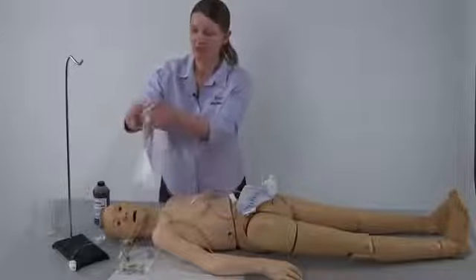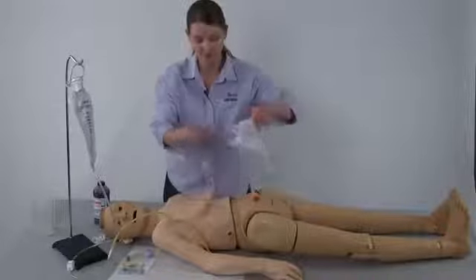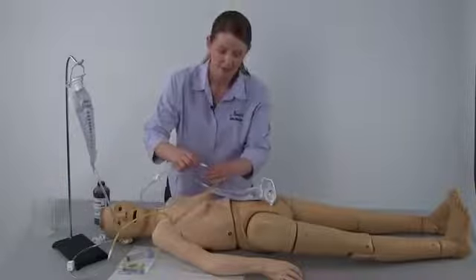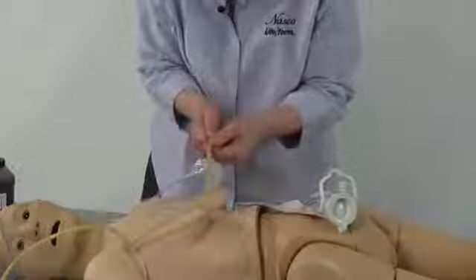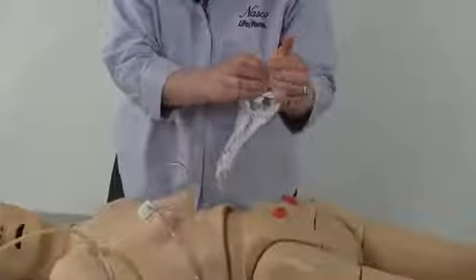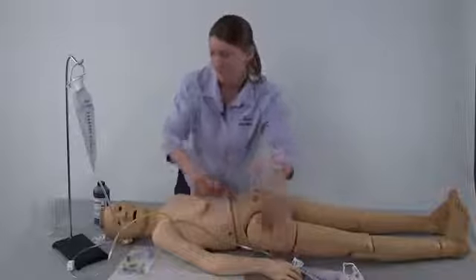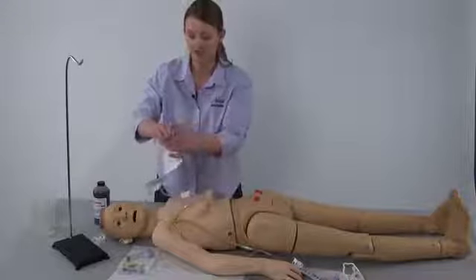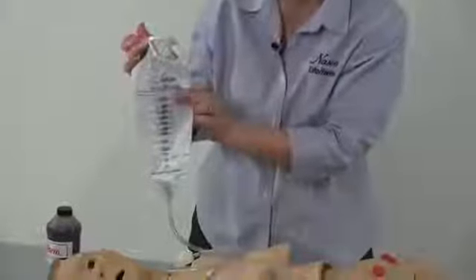This bag can be the hanging bag from the fluid supply stand. Connect the second fluid supply bag to the free tubing coming from the shoulder of the simulator. Ensure the cap on the second fluid supply bag is tightly sealed and close the pinch clamp on it. Close the pinch clamp on the hanging fluid supply bag. Open the cap and add the simulated blood into the fluid supply bag up to 500 milliliters.